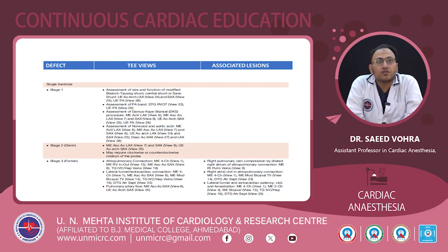In patients with single ventricle physiology, for stage 1 repair with BT shunt, the assessment of the size and function of the modified BT shunt, central shunt or Sano shunt can be obtained by the upper esophageal aortic arch long axis view and short axis view and upper esophageal PA view. To assess the PA band, the deep transgastric RVOT view and upper esophageal PA view will be helpful.